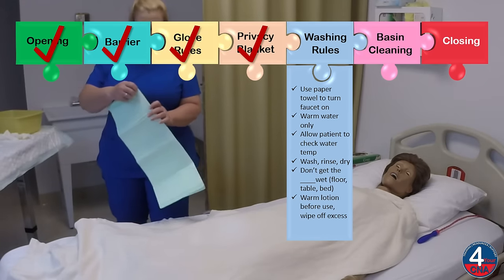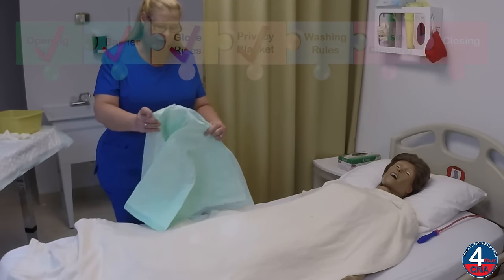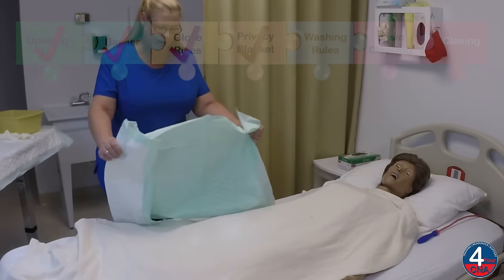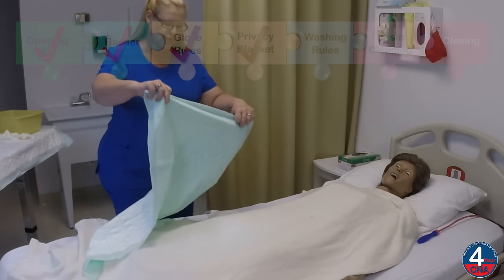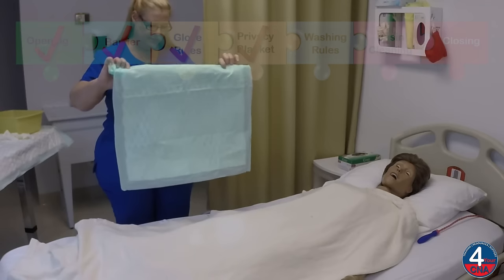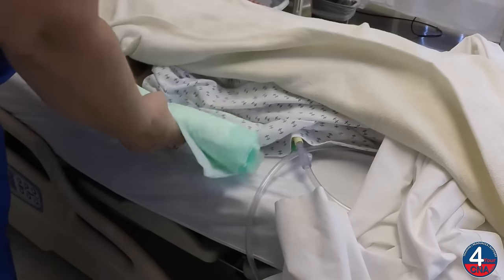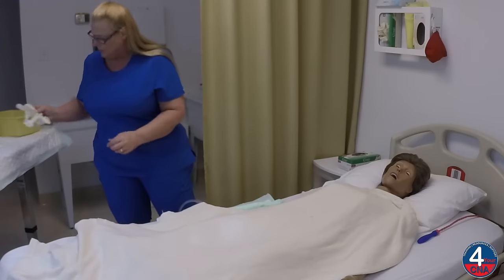Okay, Ms. Jones, I'm going to place this pad underneath you. This is going to help keep your bed dry while we do this skill. First, I'll roll it toward me and place it on the bed, and then I'll put my gloves on.